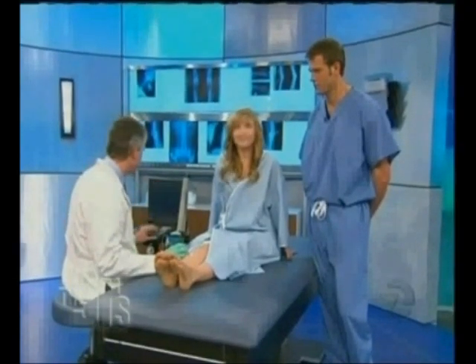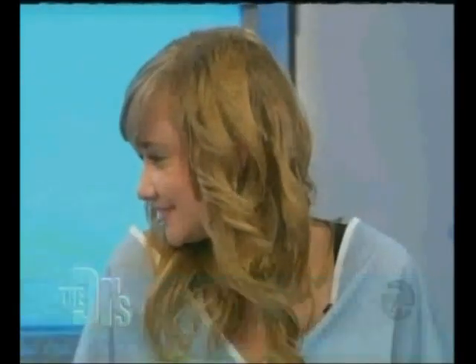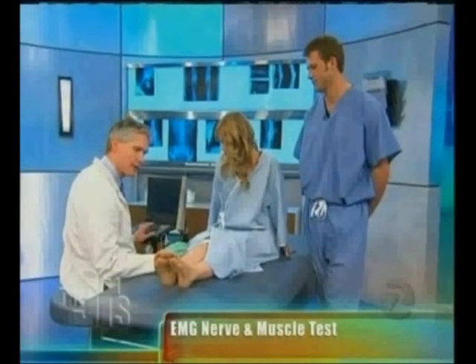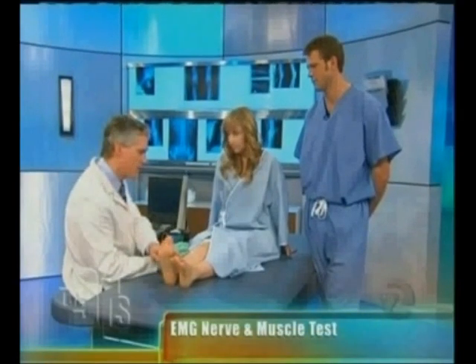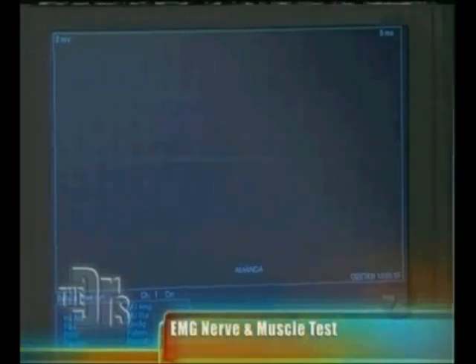I go right under the skin into the muscle. As I turn this on — that doesn't hurt, right? No, it doesn't hurt. I'm able to look and see that when it's at rest, we have a flat line on screen there, and that's what I would expect. Now when I have her bring the foot up just slightly — there we go — you can start to see those waveforms clicking and popping in there.